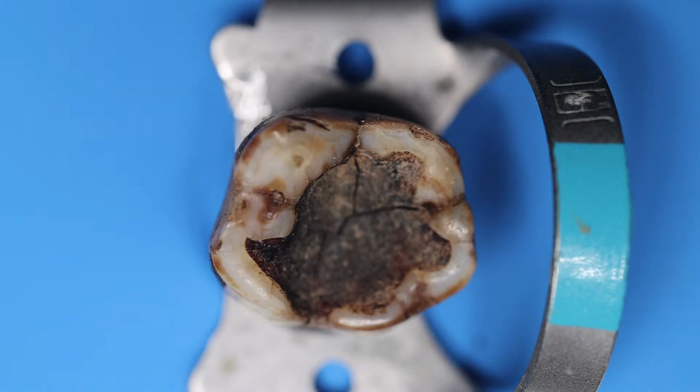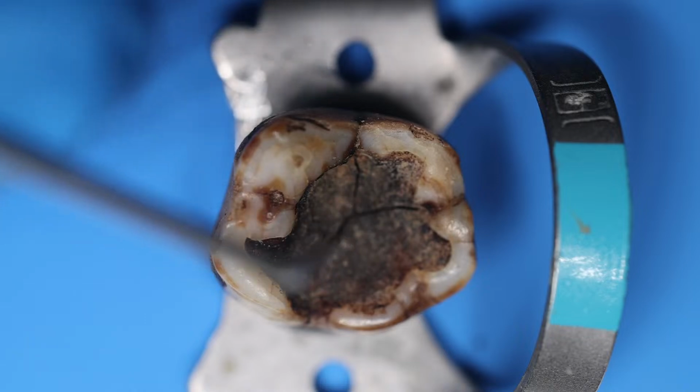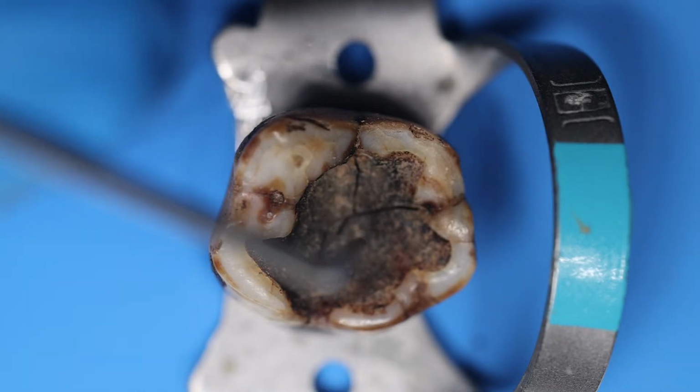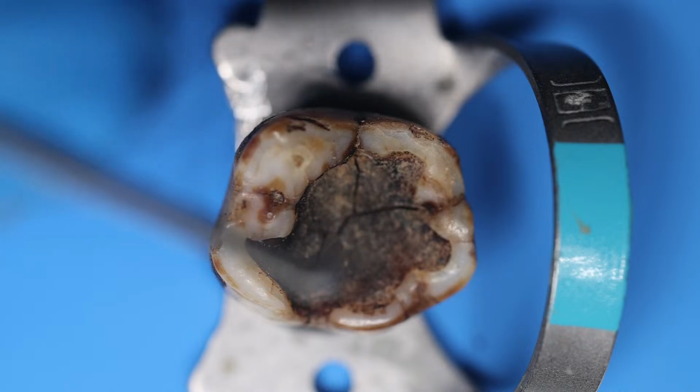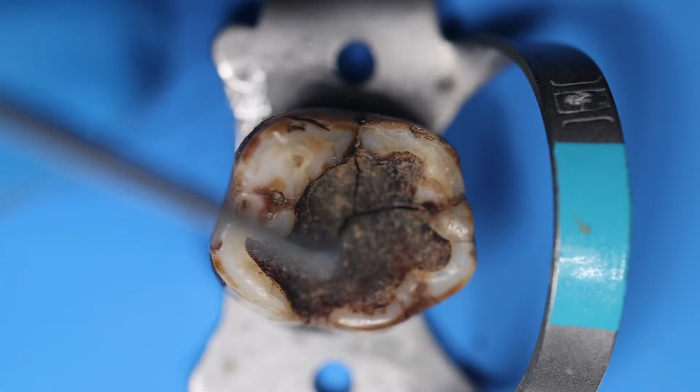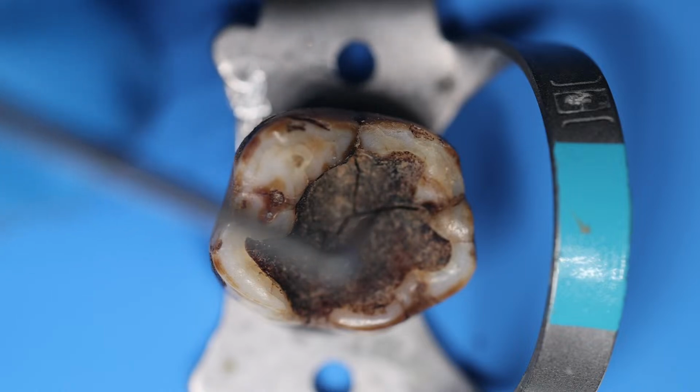Now, where to start is always a question amongst us. See, this is caries and it is involving almost all of the occlusal surface. So anatomically start from the center, because whenever you are going inside the tooth and entering the pulp chamber, you will get a drop inside, and in the center it is likely that most of the canals are located from the center to the mesial aspect. So we don't need to go much distally in almost every case.